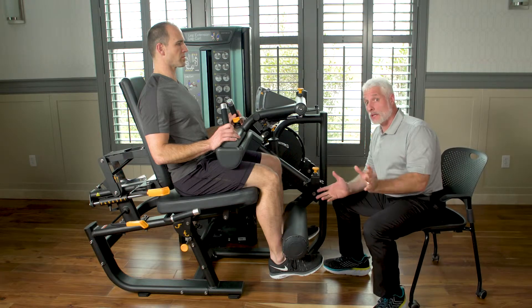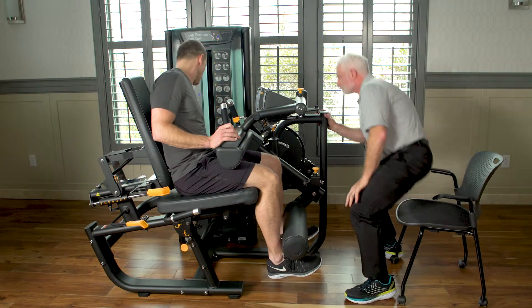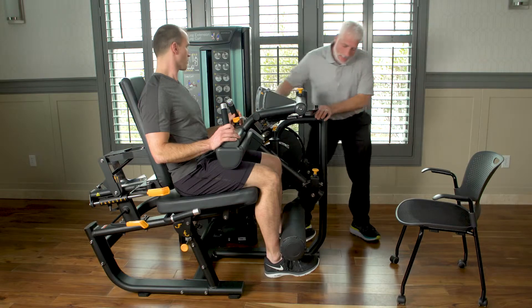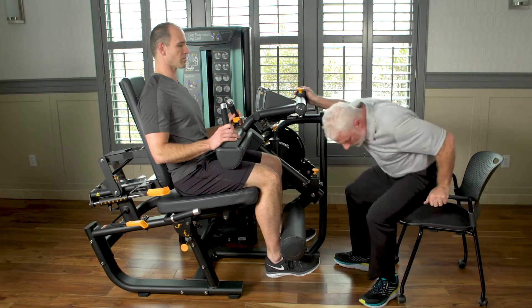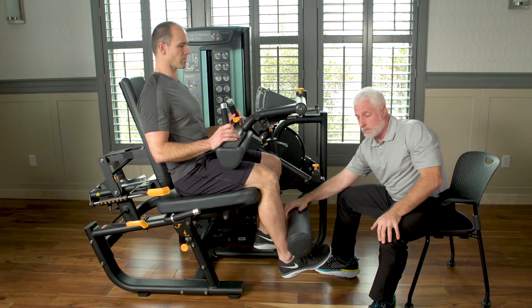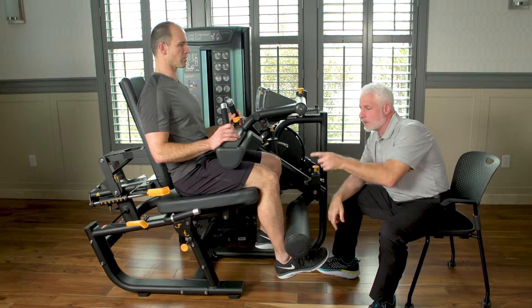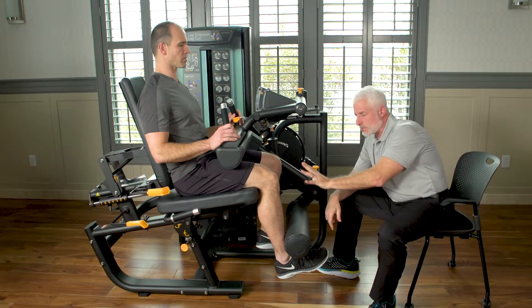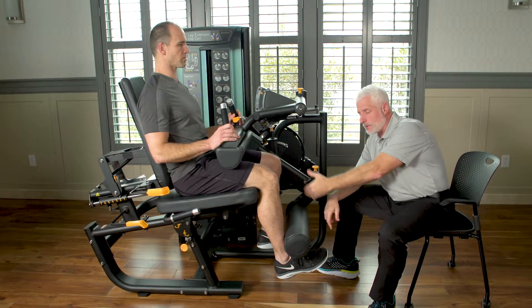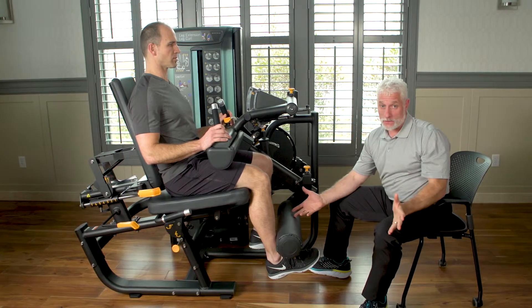Assuming he's got a right total knee, we're going to lighten the weight and range limit again by pulling out the knob, pulling it down, and locking it in wherever we choose. Then single leg, we're going to bring this up and then back down, engaging the quad. For this patient population, keep it lightweight, and as he progresses in therapy, open him up to gain more strength throughout the full range.